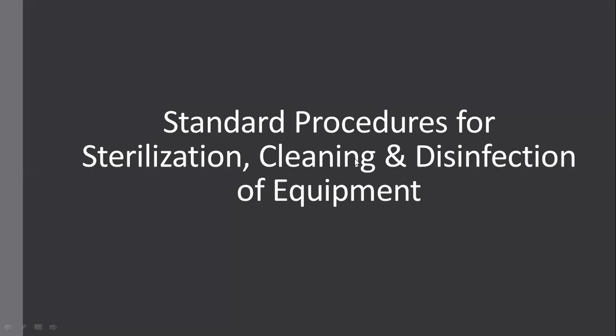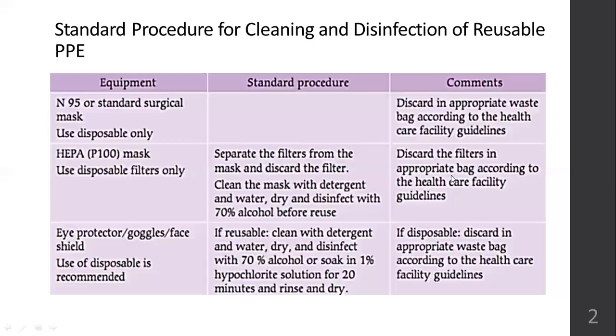So those who have the textbook, just mention the page number in the chat box. Standard procedures for sterilization, cleaning, disinfection of equipment. Few tables are there that we will discuss for today. Okay.